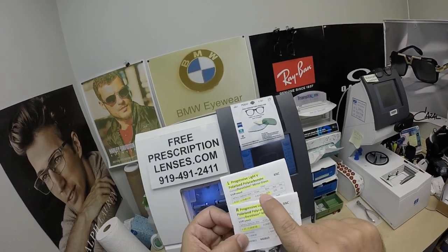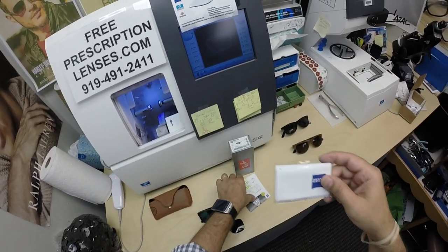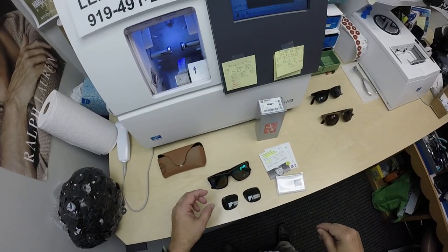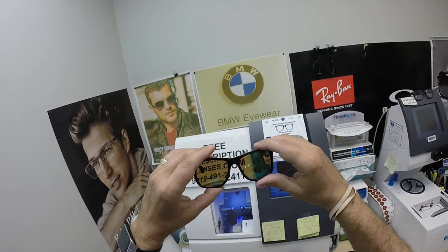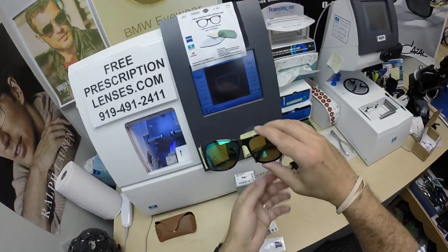I've highlighted the prescription for his right eye, same for the left eye. And of course you're going to get these — the packages from Zeiss. You're going to get the Zeiss cleaning cloth as well. He's also going to get the original lenses that came with the frame. He got the Zeiss polarized brown with the green mirror.